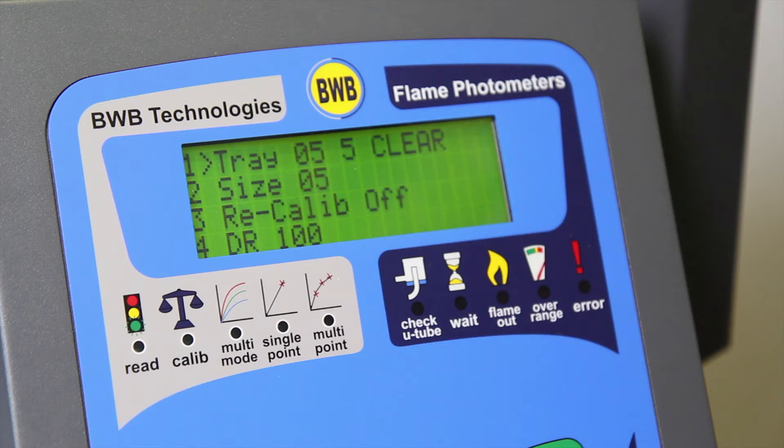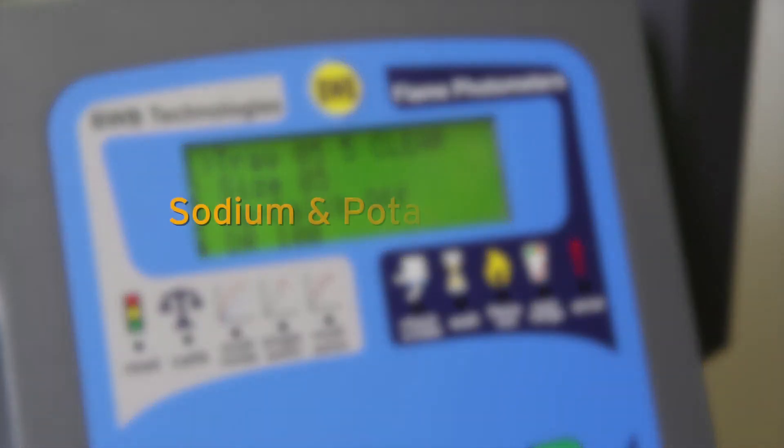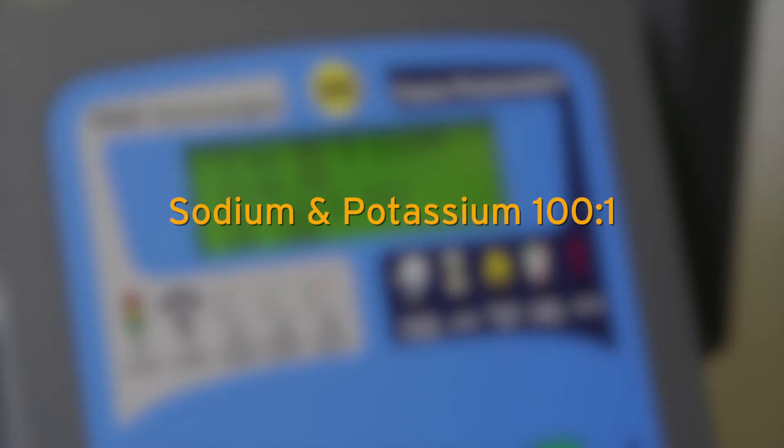Option 4 allows you to view the automatically set dilution ratio. Sodium and potassium have a dilution ratio of 100 to 1, whereas lithium and calcium have a dilution ratio of 10 to 1.